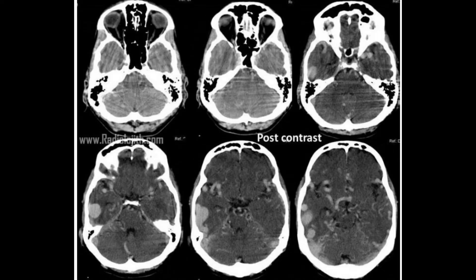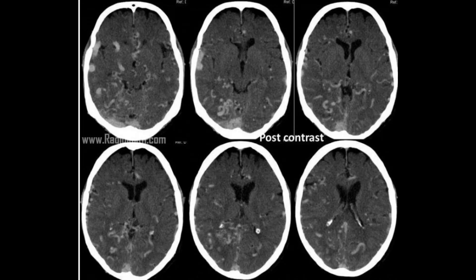No such vascular connections are detected in the circle of Willis. MCAs and basilar artery are visualized. The thalami, basal ganglia, and brainstem appear unremarkable.